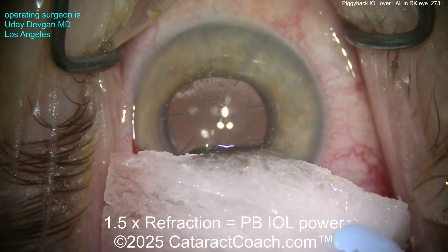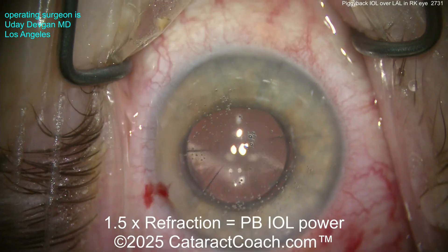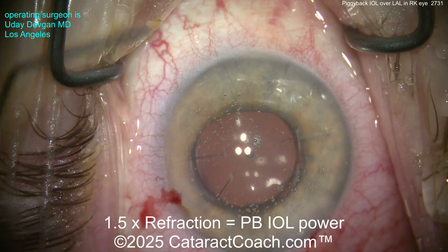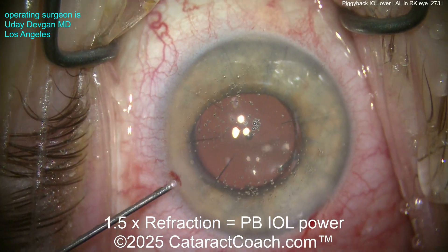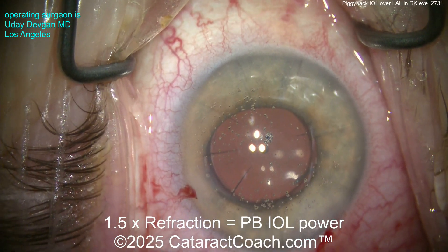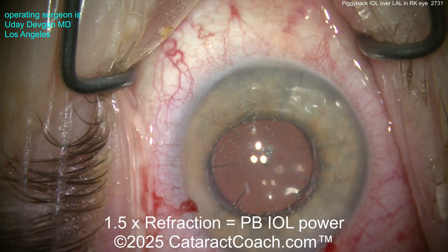Now at the end we're using a Wexel sponge soaked in tetracaine. What does that do? It's hypotonic, so it's going to cause focal osmosis — you'll get fluid from the tetracaine sponge going into the cornea. It causes a little bit of focal swelling, which helps seal up the incision. That's a nice little trick. You definitely want to make sure the incision is sealed up nicely.